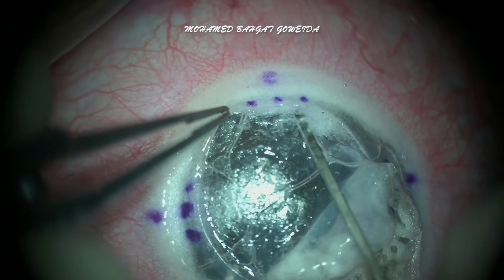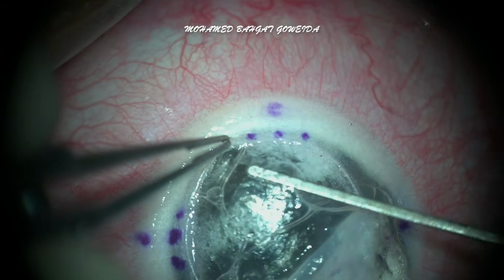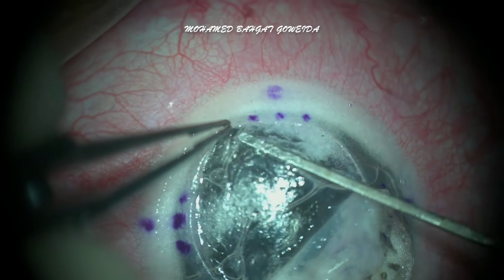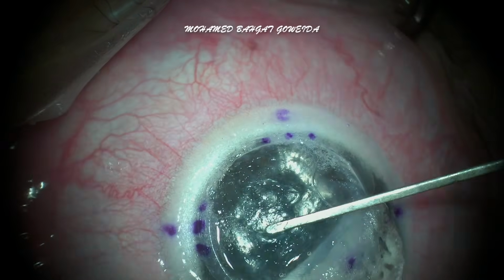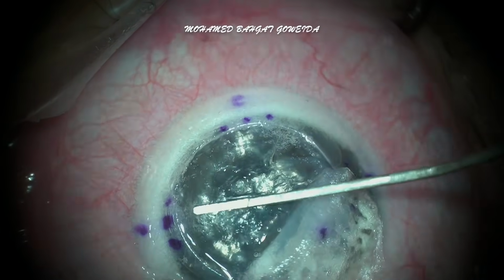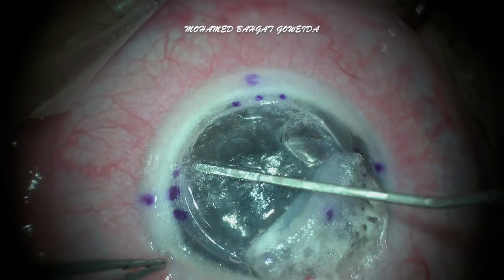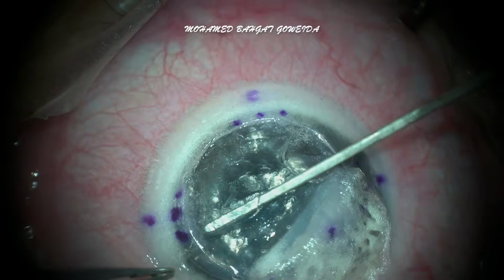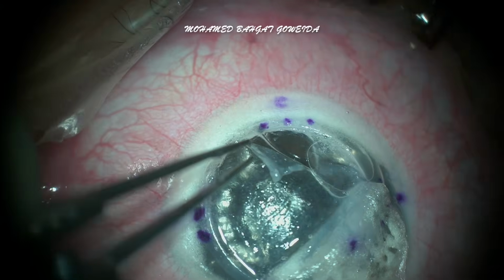Then incision on one of the stromal microbubbles was done with introduction of a blunt spatula to guide to a deeper stromal plane. It is to be noted that the dissection continues from the safer areas toward the site of the perforation. After completing the dissection in most of the cornea, avoiding the perforated quadrant, cutting of the dissected stroma was done.